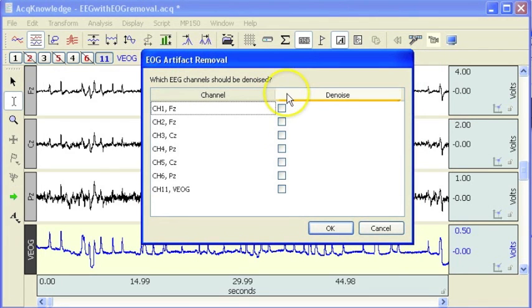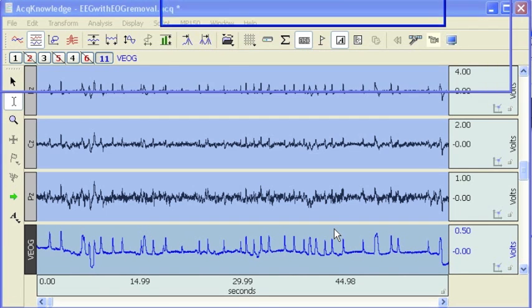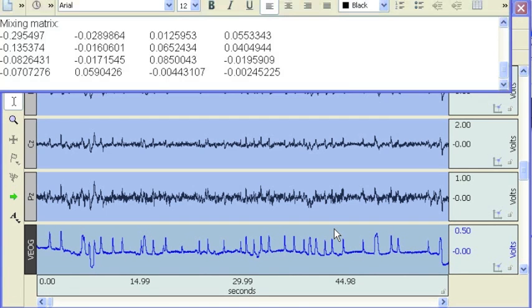Now we're asked which channels we want to analyze. So we want FZ, CZ, and channel 4, PZ. And we're going to hit OK. This takes a little while.